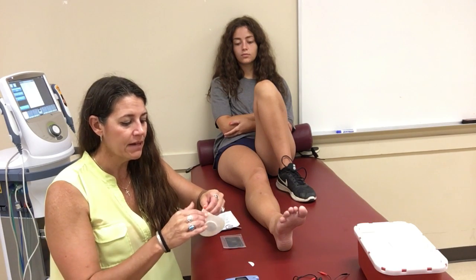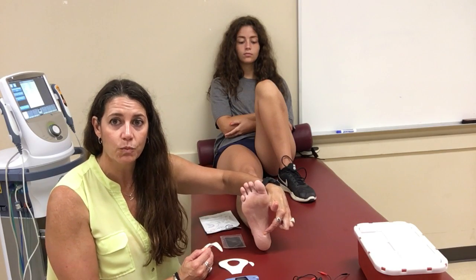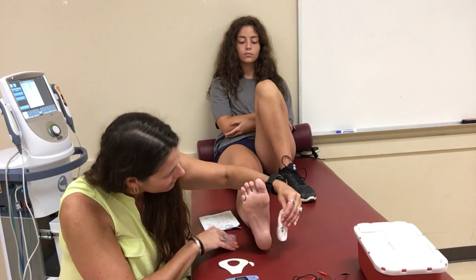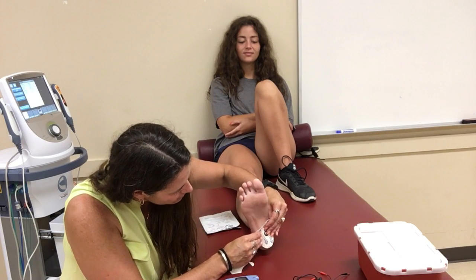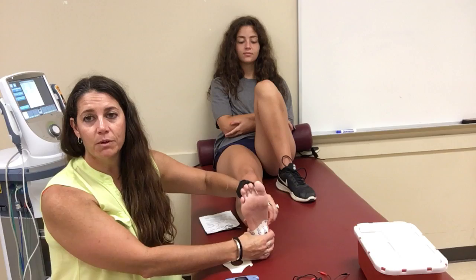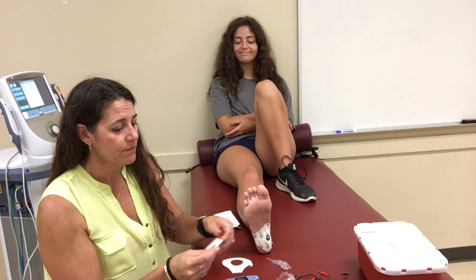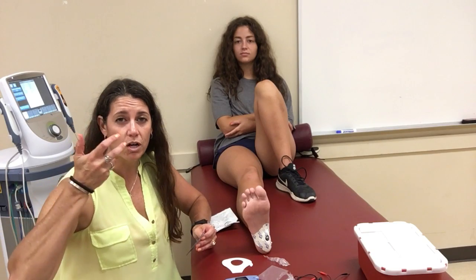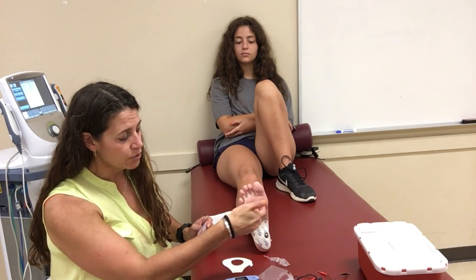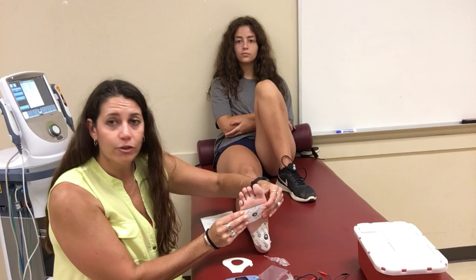For an iontophoresis treatment, the active medicated pad goes directly over the place of pain and inflammation. For plantar fasciitis, that's typically right on the heel where they complain of greatest pain. Place that pad right over that spot. The other key concept is you're trying to pull the drug through the body part — if the problem is the plantar fascia, you want the drug drawn through it, so place the ground pad further down on the foot.